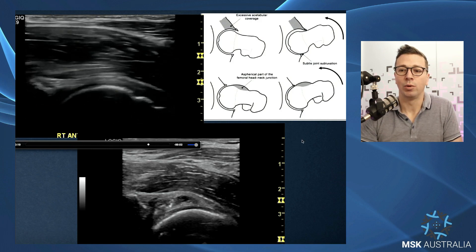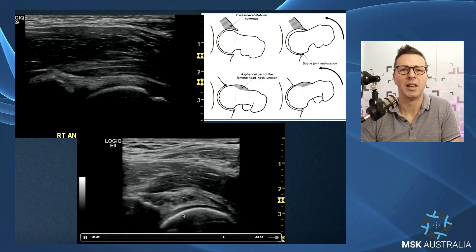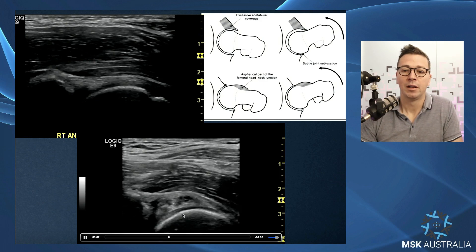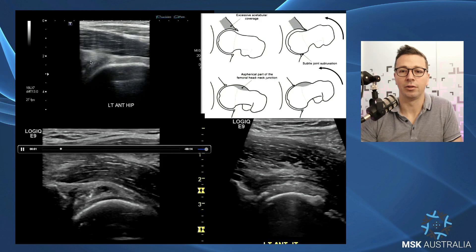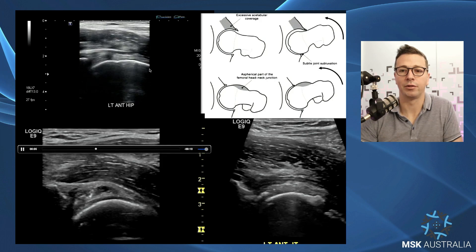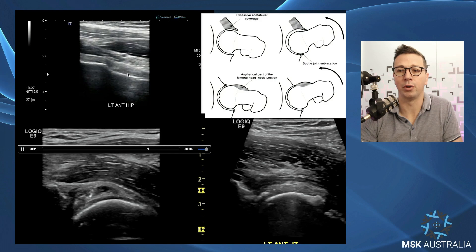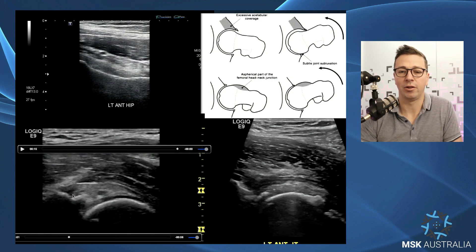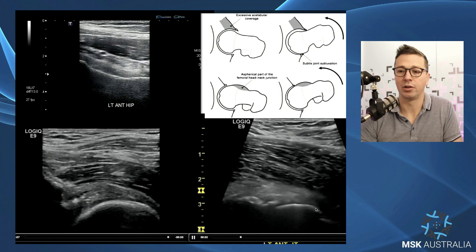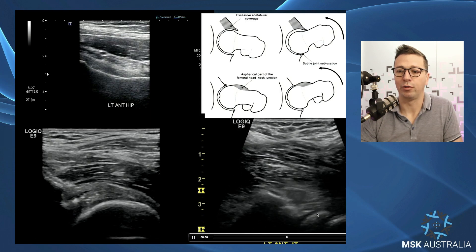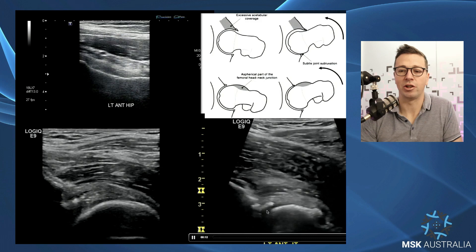We can appreciate cam deformities sonographically. From the femoral head-neck junction, going to the supralateral component, we often see that extra bit of bone on the side — about 20% of the population have these, so you'll see them not uncommonly. Femoral acetabular impingement syndrome in the latter stages can lead to significant hip joint osteoarthritis. So your femur and acetabulum butt together, causing degenerative changes in the antero-supero-anterolateral joint.